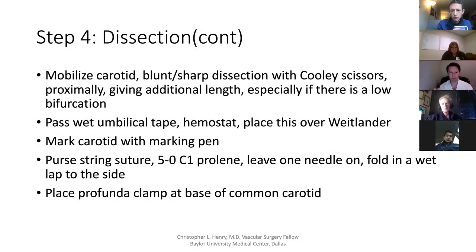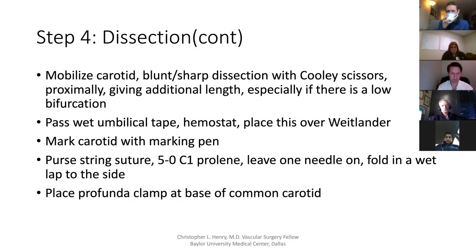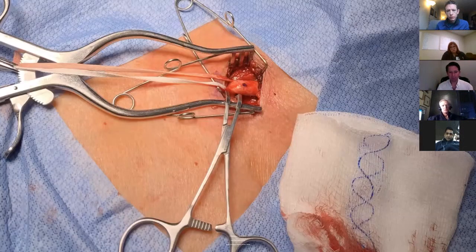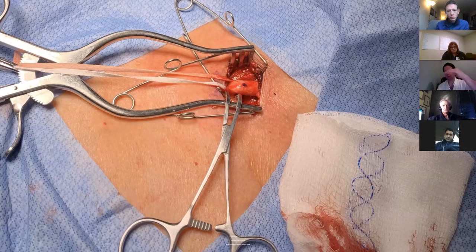You don't want a full-thickness bite of the carotid. Make a nice purse string, snip one needle off, leave another needle on, and typically put that into a wet lap, fold it up, and place it on the side of the neck so it doesn't get tangled. Then we preferentially use the Profunda clamp — it slides in nicely, has a low profile, and keeps everything else out of the way. The two springs, the wet umbilical tape on a little bit of tension in the crotch of the Wheatlander on a hemostat — this brings the carotid up into the operative field and gives a nice working angle as you place your wires and stents.